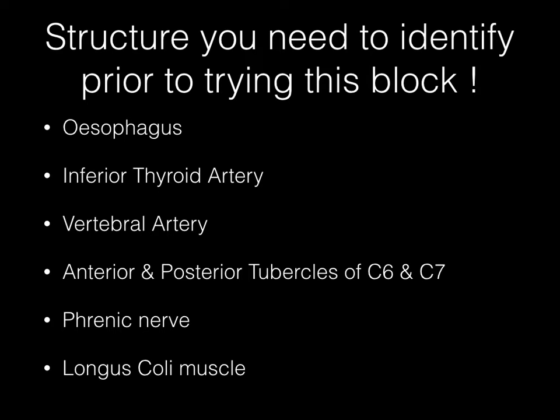If you put your ultrasound probe over C6, you see this tubercle, very angulated, like a sharp nail going up. So it is C6. If you pull the transducer a little bit below, it disappears.